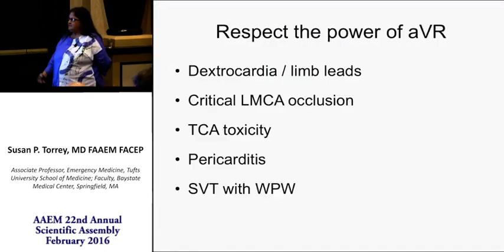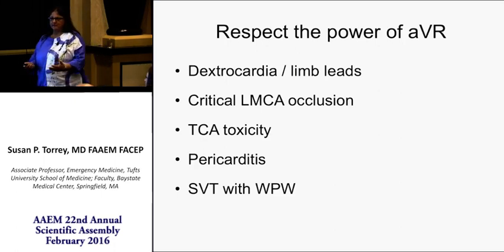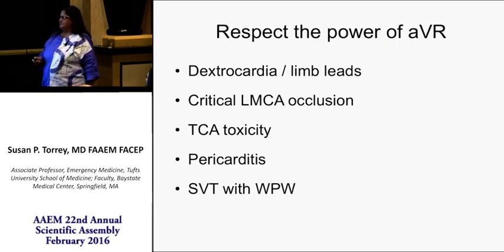And so I end by saying, respect the power of the AVR. You can determine dextrocardia or limb lead switching. It can help with ACS presentations, toxic ingestions, pericarditis, and occasionally help you discern the mechanism of SVT.